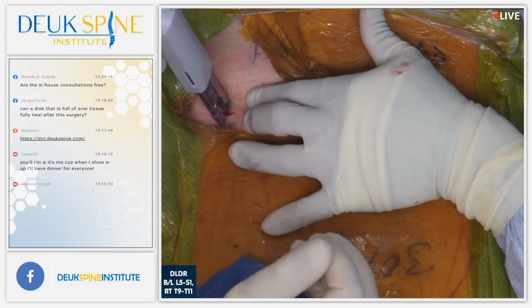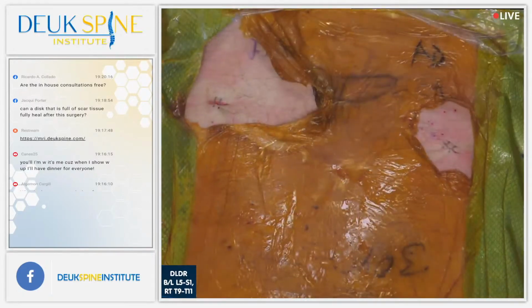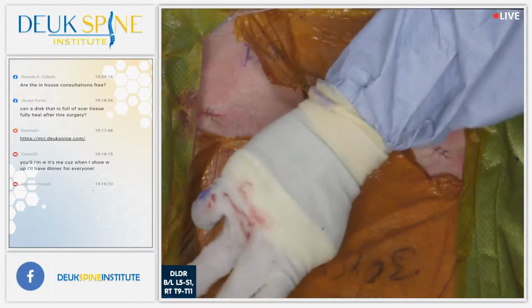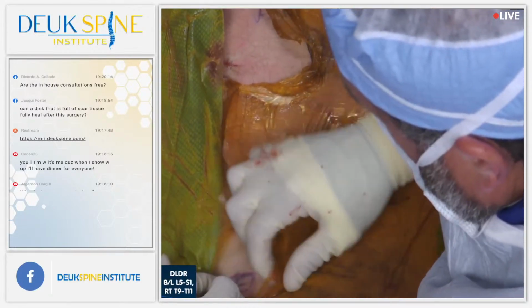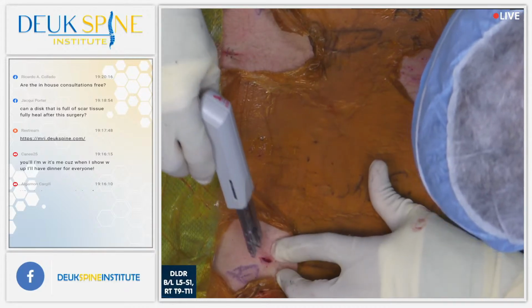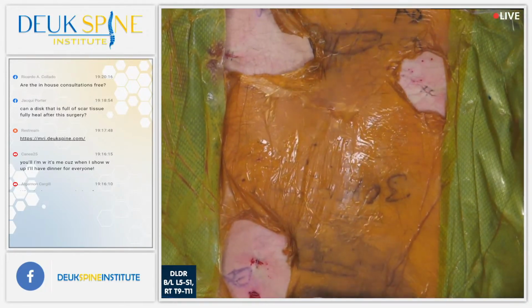But just so that we don't get any blood in the muscles of the back, I put pressure, because once you get a blood clot in there, it's going to cause pain. The patient's going to have pain in their muscle for months after surgery, and they're going to complain about it and be unhappy until it dissolves and goes away. So rather than deal with inflammation in the muscle, called myositis, from a clot from surgery, it's better to control the bleeding and keep it down. Don't let it bleed, by putting pressure if you have venous bleeding.